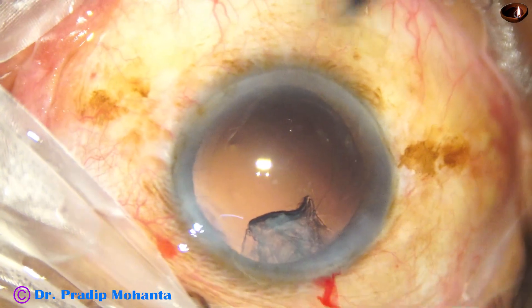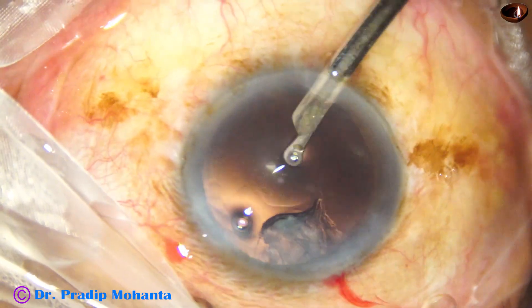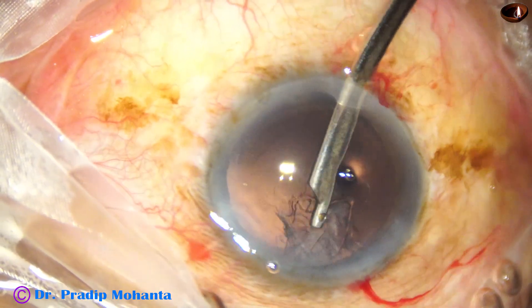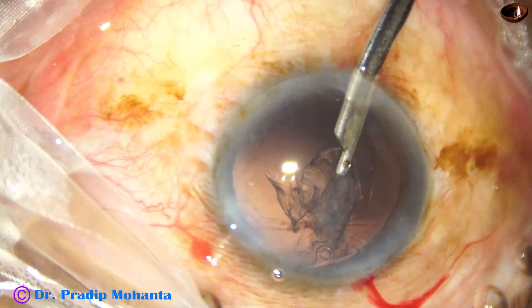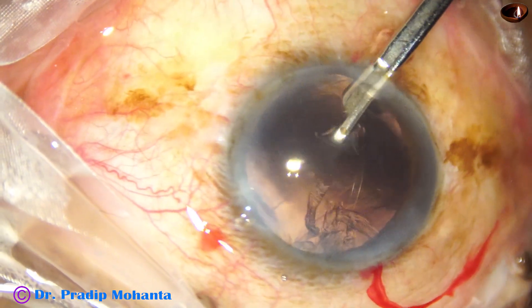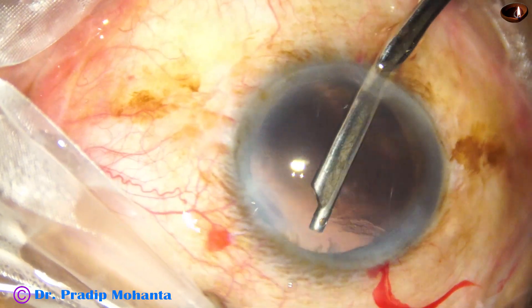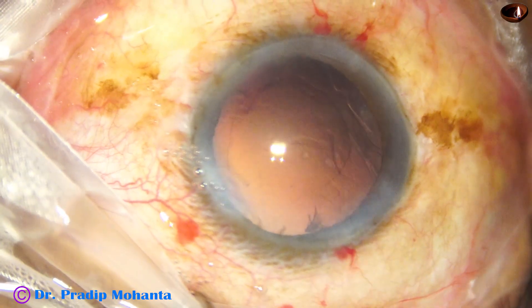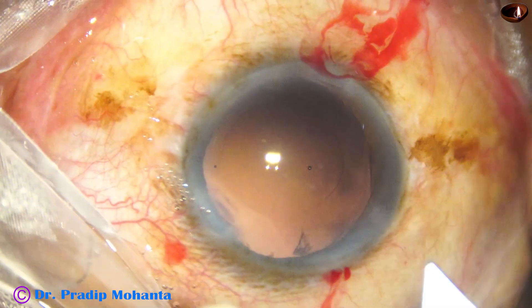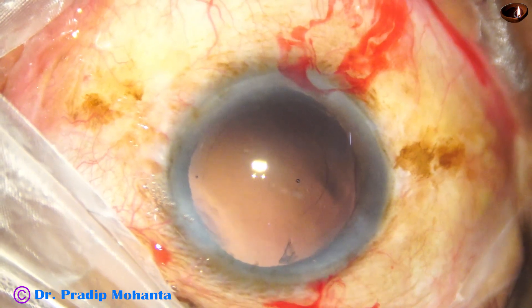My plan at this time is to make a port at 7 o'clock, then use the SIMCO cannula pulling very gently so I do not catch the capsule, and ultimately it comes. A very small fleck is remaining — let it be. In challenging cases we must not try to be perfect, because if we try to be perfect then some problem can happen.